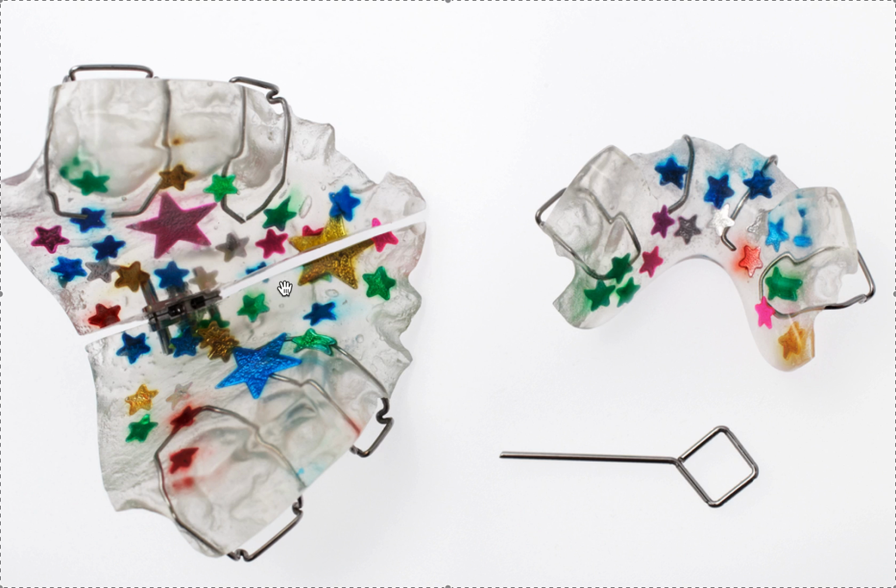At least you don't need surgery, hopefully, and other stuff like that. And you reduce the likelihood of having impactions or needing premolars out or anything like that. So that's the benefits of doing these appliances. So that's pretty much it. Now you know the difference between a MacNamara and a regular twin block.